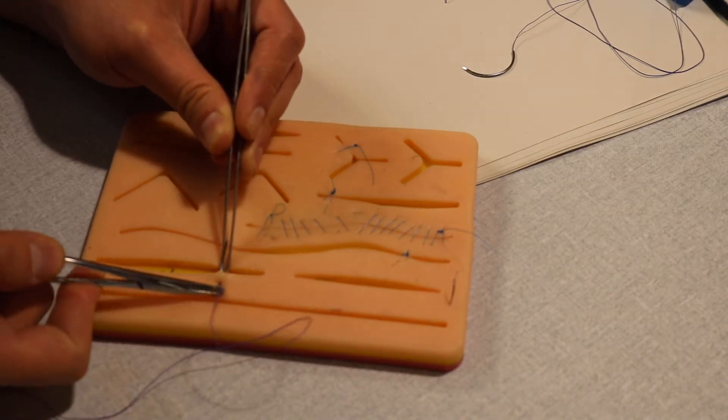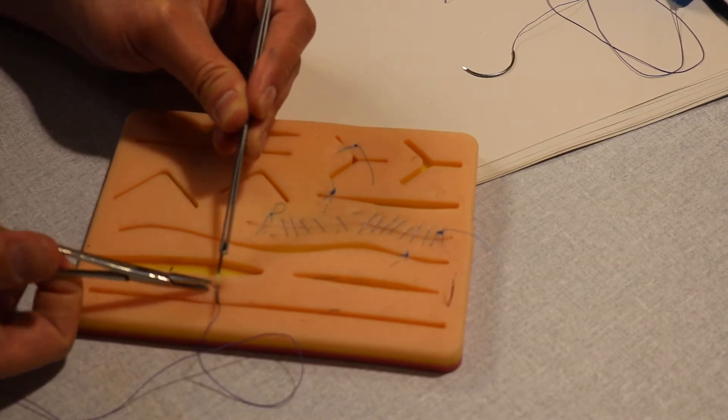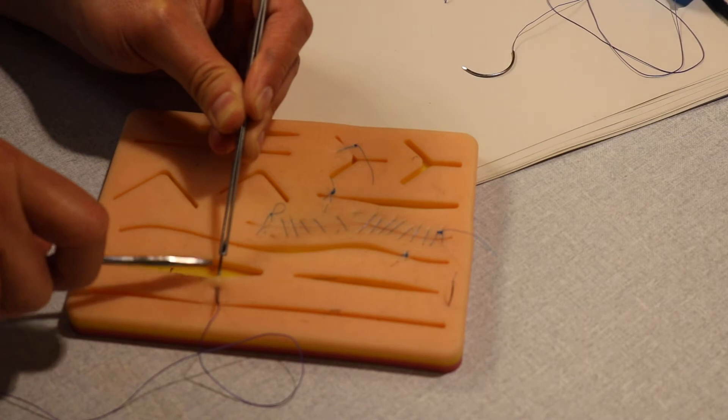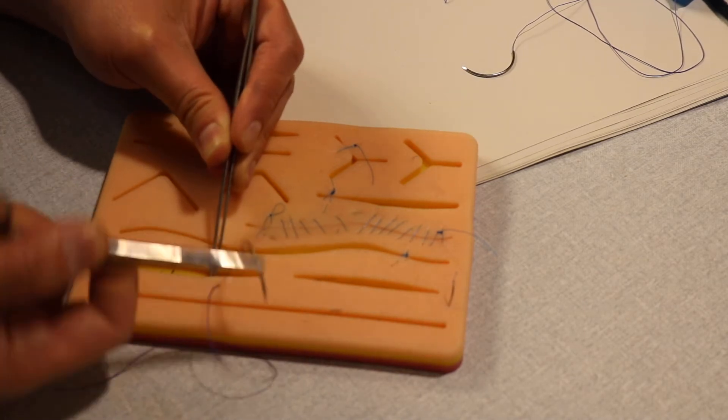One of the pitfalls: people push. Don't push, rotate. Take it. And one of the pitfalls: people don't rotate their hand again to pick it up. So you need to rotate your hand again to pick it up and take it out.